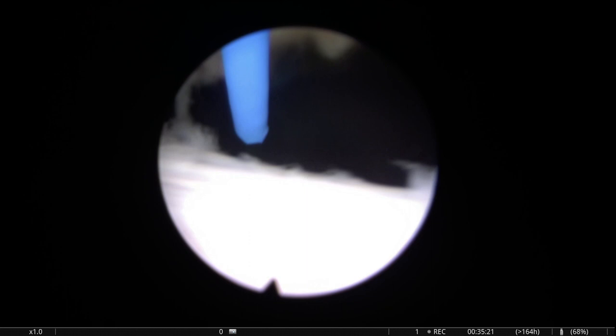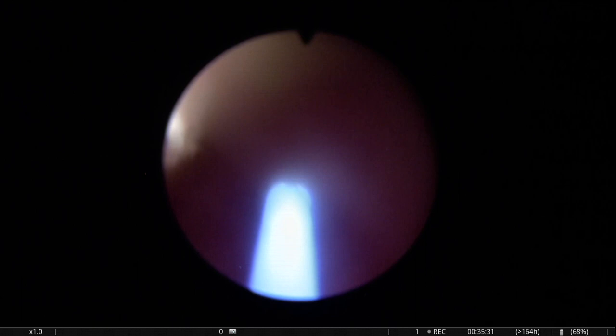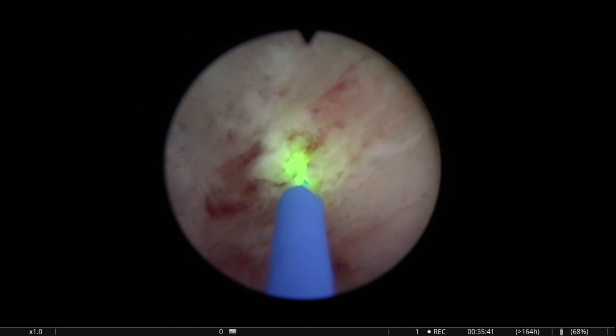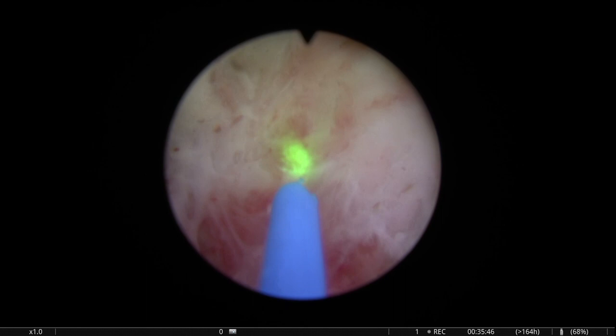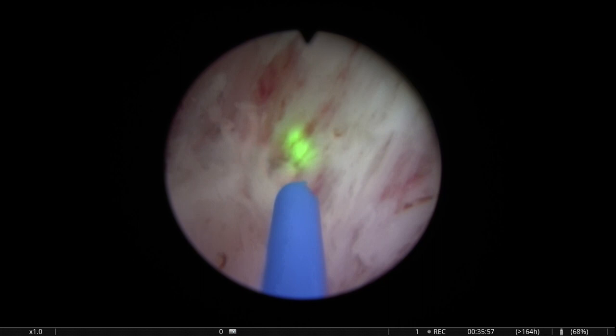All right, so we achieved reasonably good hemostasis. Maybe there's some small bleeder. It's very easy to tilt, to push the adenoma into the bladder, and then we will do the trimming phase and the hemostasis phase. This is what we are seeing now, that with pulse modulation, it is not so needed anymore, because you get a much better first pass hemostasis. But overall, I think the visibility is quite good.